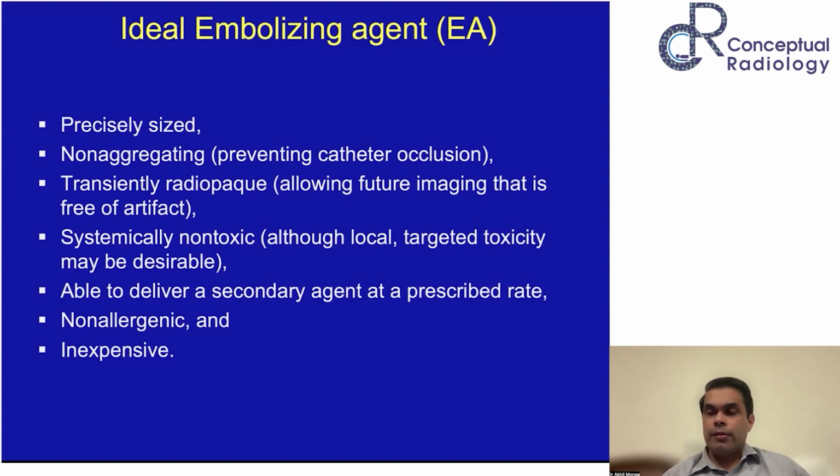Although sometimes in cases like TACE, we do combine them with certain toxic materials which can get deposited in the tumor to cause tissue damage. So that is another property it should have. It can have the secondary property of delivering another agent, so it causes embolization, but can also bind an agent and take it through and deposit it into the place where we want. Then it will not be just an embolization, but maybe a chemoembolization.